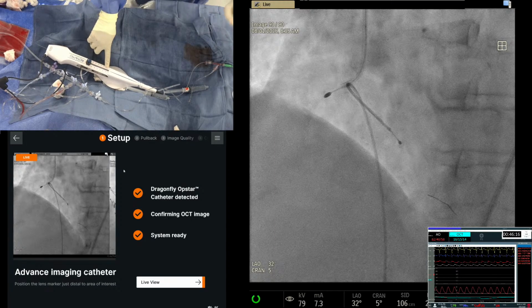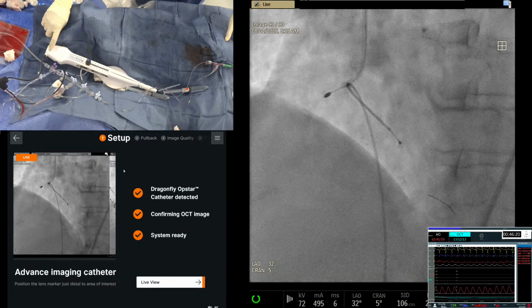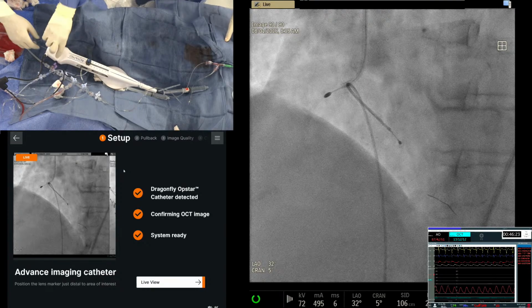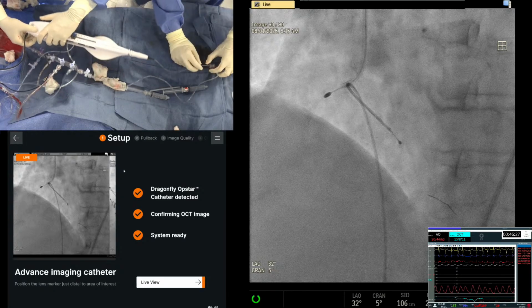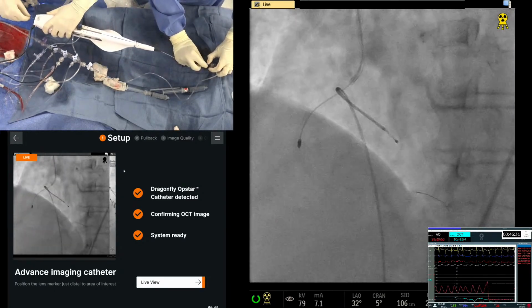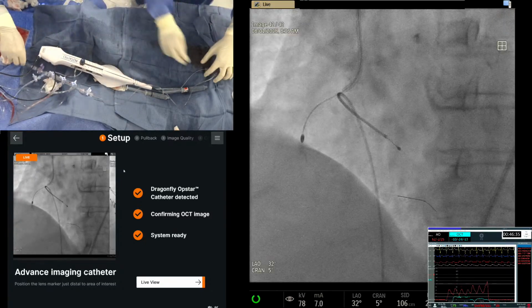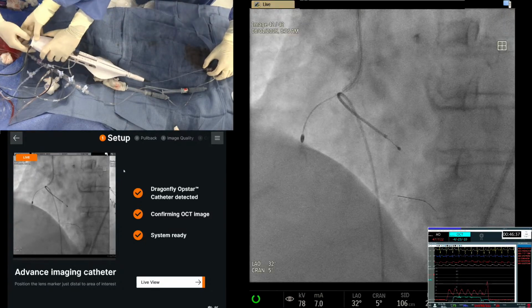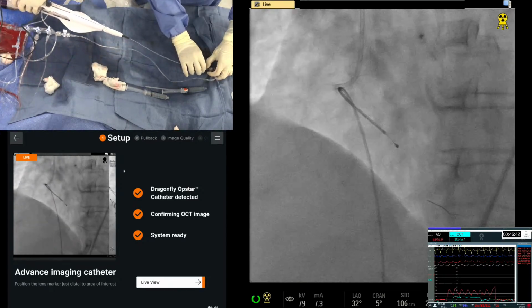So suppose we wanted to do PDA, that is the time we have to do it. Let's go fast because she's having ST elevation. Go Dynaglide. Here, brake release. This is tight and this is where I move. You see that? And now I get the entire length. Okay, stop. Perfect. This length is still there. Okay, we're coming out. Start coming out. Get the run-through wire. Get the run-through wire.